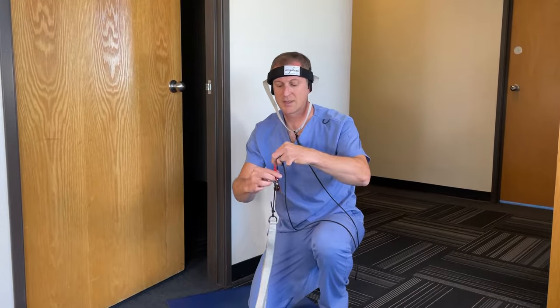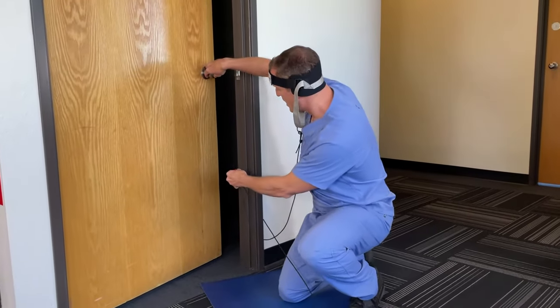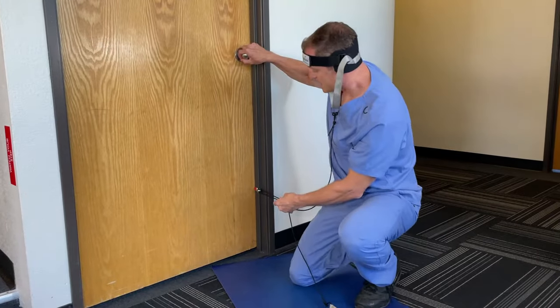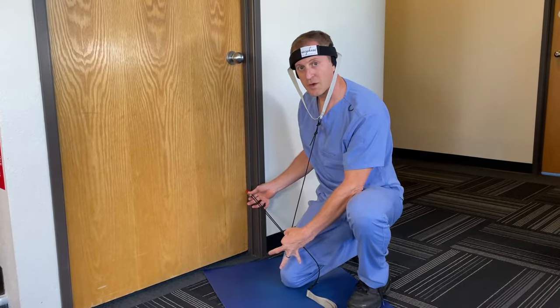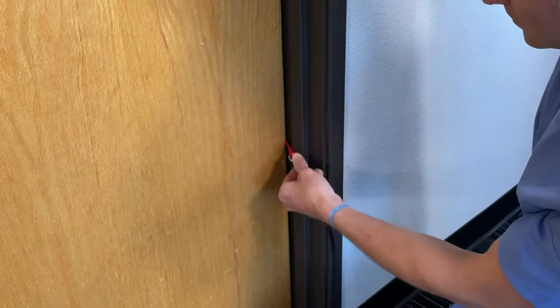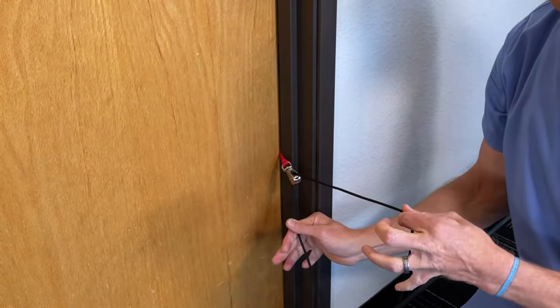The next thing you want to do is take the red paracord or colored paracord part and secure it in the door about 6 to 12 inches off the ground, so that you get about a 20 to 40 degree angle when you're laying down. Carefully place the black pull tab and knot of the colored paracord behind the door jamb and check that the door is securely closed.